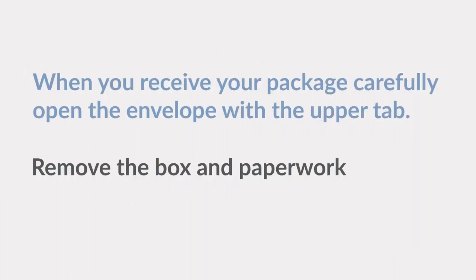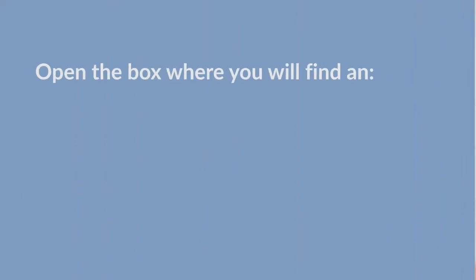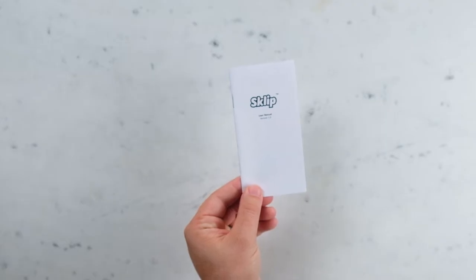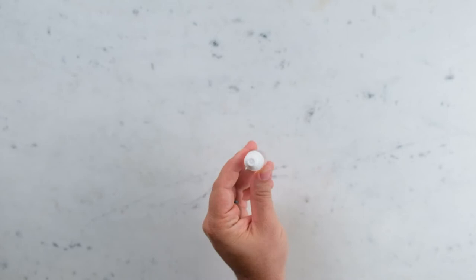When you receive your package, please carefully open the envelope with the upper tab. Remove the box and paperwork. Open the box where you will find an instructions manual, dermatoscope, charging cable, and dropper bottle with dermoscopy oil.